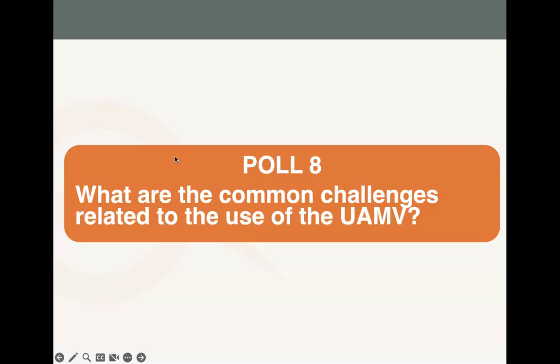Yeah, then just another quick comment. One of the things that I see us as anesthetists really not paying so much attention to is, again, the usual regular machine check. With time, we tend to relax. And each time you report for work in the morning, you just want to switch on the machine and then connect your patient and things like that. So we need to remember that the vent operates like a computer.